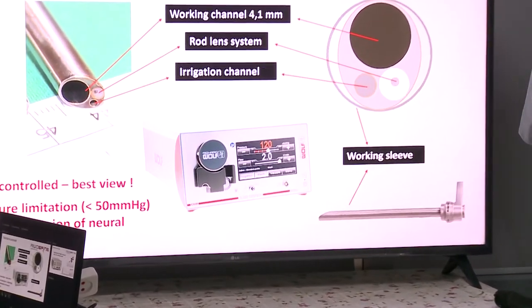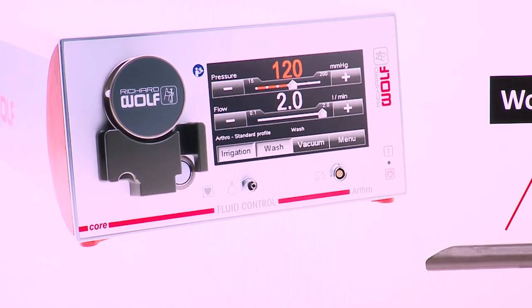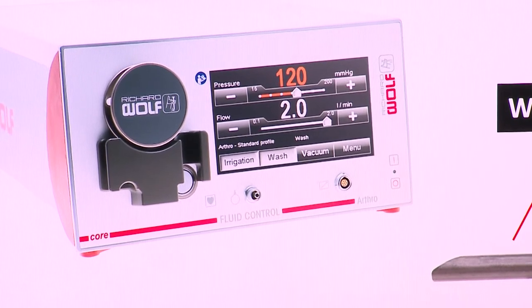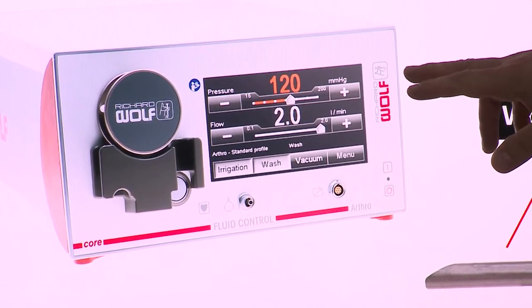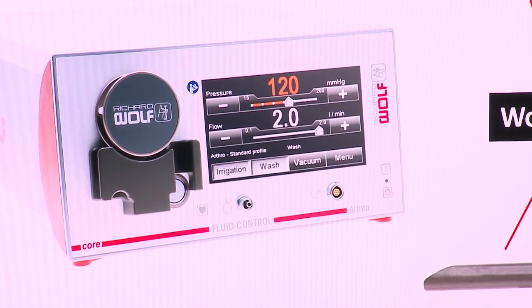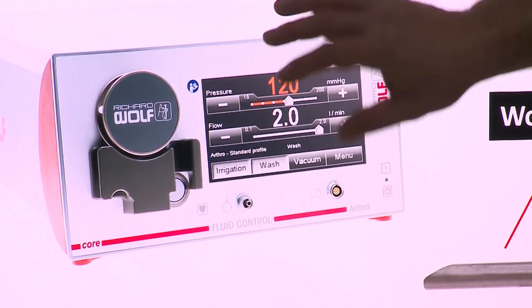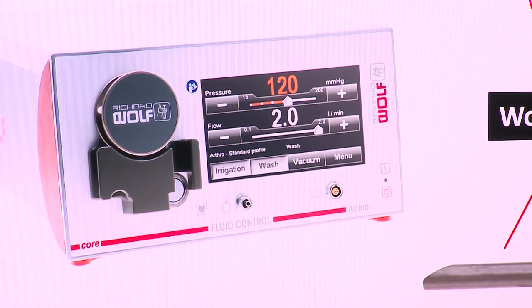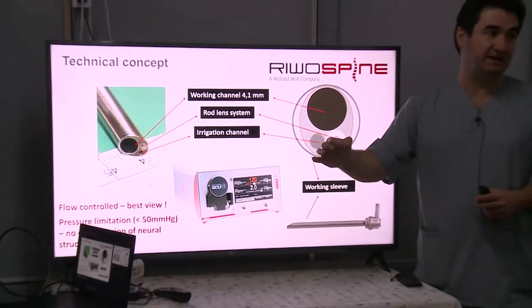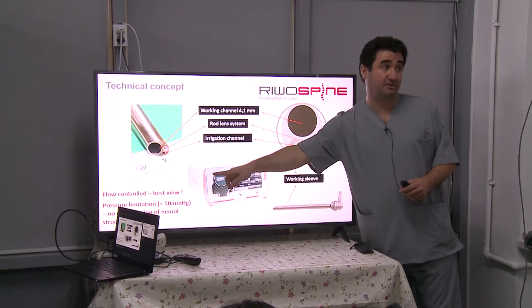Another safety for the fluid management for us is the fluid control pump. We just use it in the spine mode. In the spine mode, we don't set up the pressure. As we discussed, when you connect the system to the pump and calibrate it with the pump, the pump recognizes the pressure inside the spinal canal, and according to that, never allows it to rise above 50.